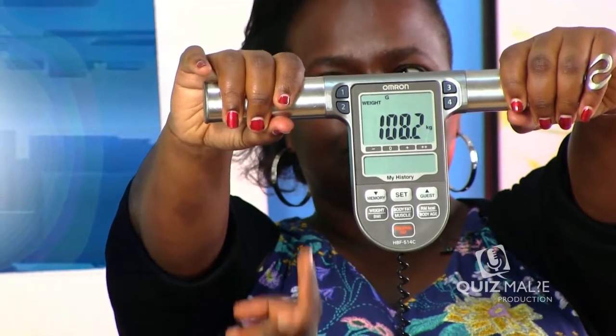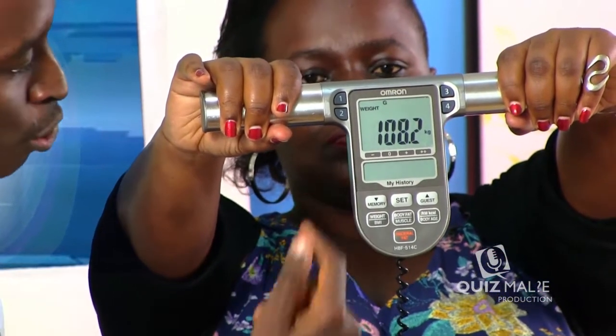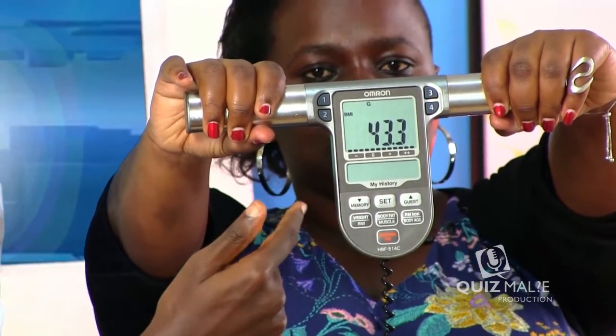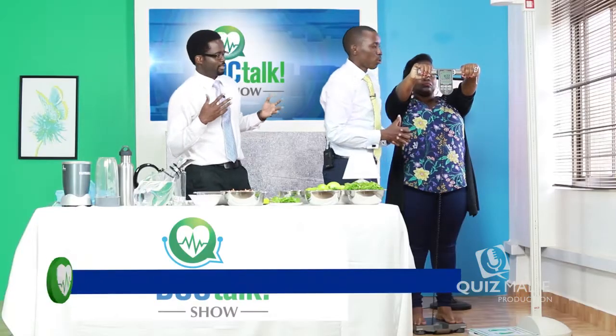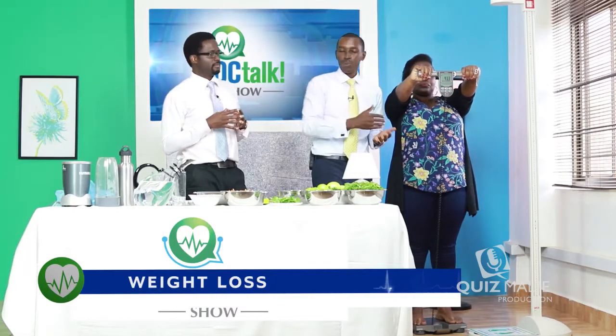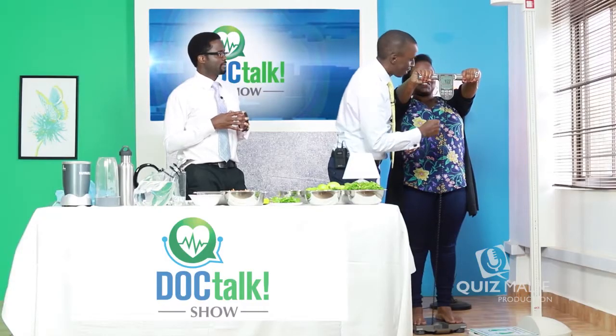So if you look right there, the weight displayed is 108.2 kilograms, and the body mass index is 43.3. What does that mean now? So that puts her in the category of overweight, or in the obese category, but we are going to try and bring that down. Our target is to get her down to somewhere in the 70s, I hope.